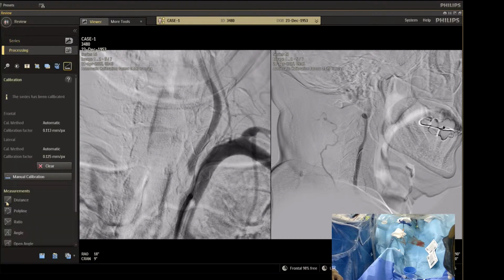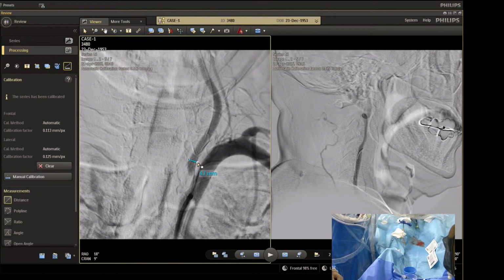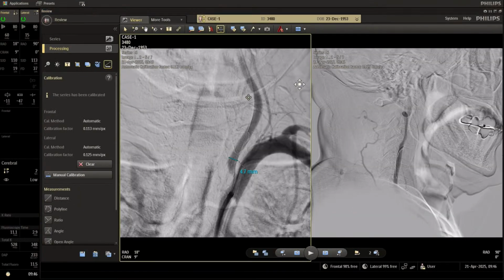The problem with the material, and now we have a 4.5 stent. Four and a half by 9 stent. I became older and older.